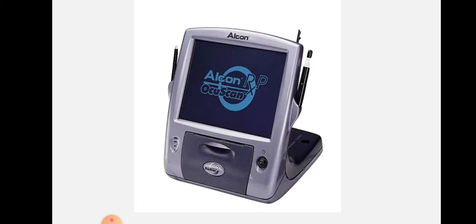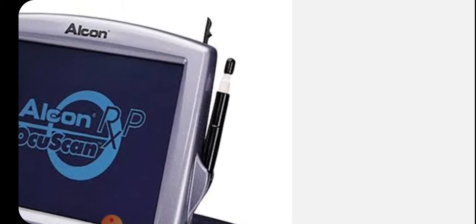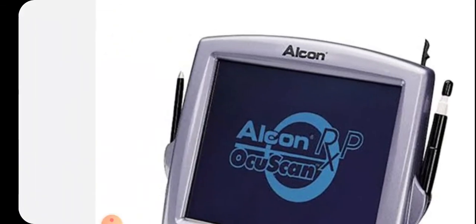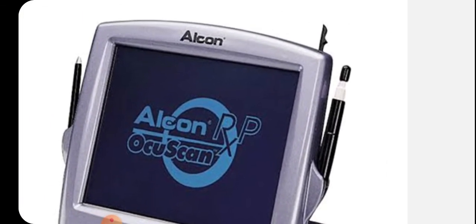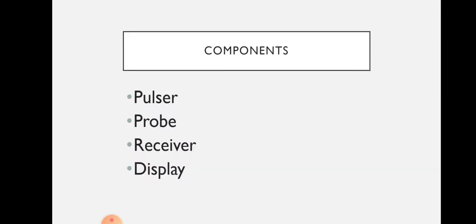Now you are looking at the A scan machine. It is from Alcon, where A scan as well as pachymetry can be done. So this probe is the A scan probe, and the other probe is the pachymetry probe.